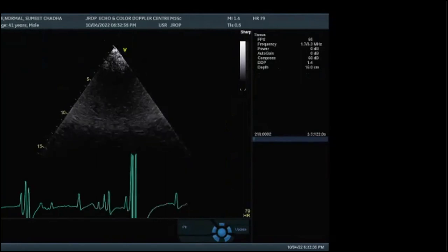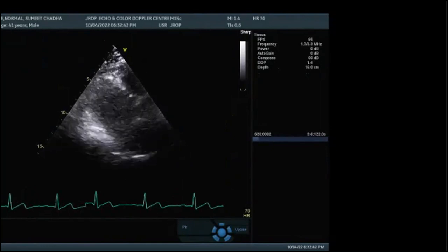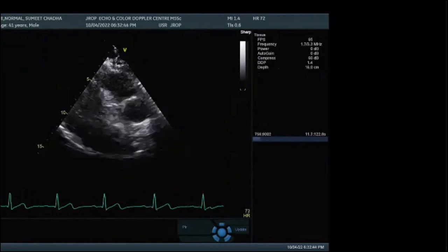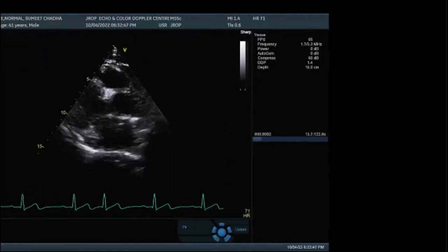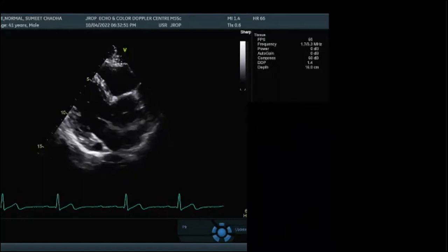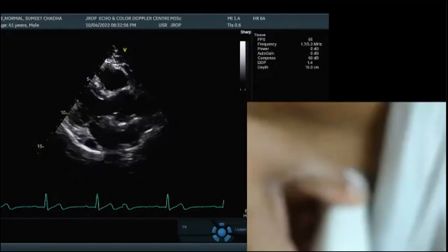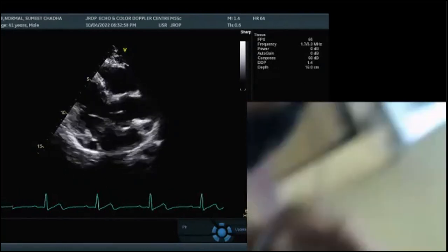I would like to see how to do it. I'm showing you, just give me a sec. In the first class, we had discussed that the index marker should be at 11 o'clock, and then for short axis, rotate to 2 o'clock and see accordingly.